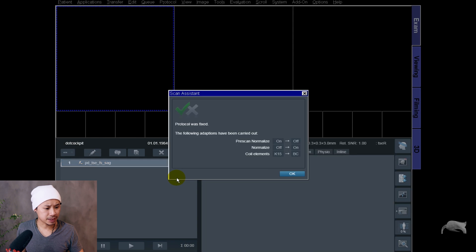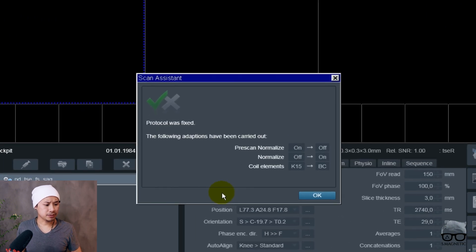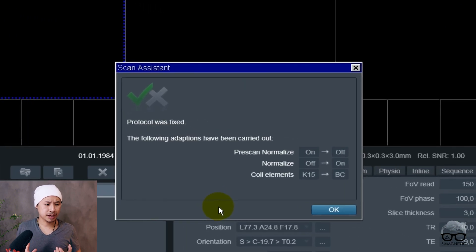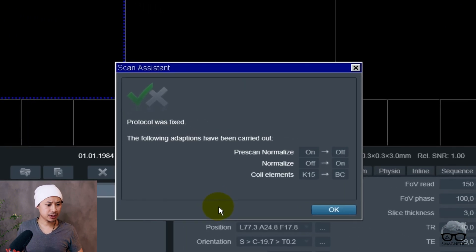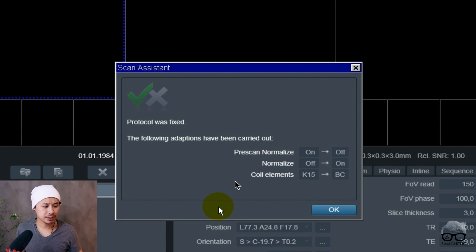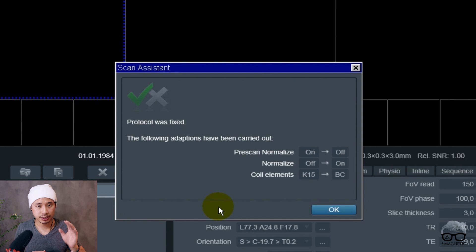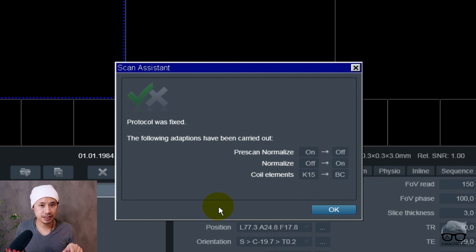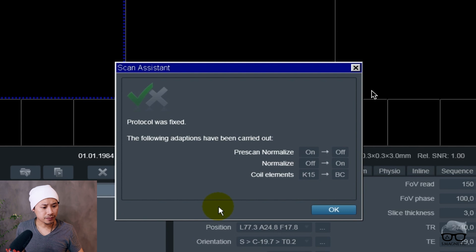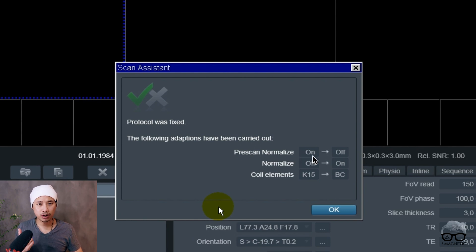Something is wrong here. Protocol was fixed. The following adaptations have been carried out. If you're new to the system I highly recommend you to read through this before just clicking the OK button, because there are a few things here which are very important.